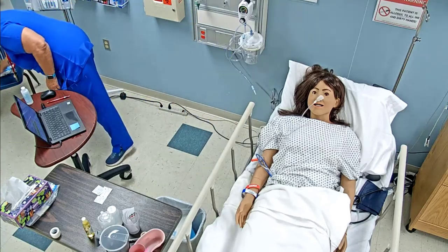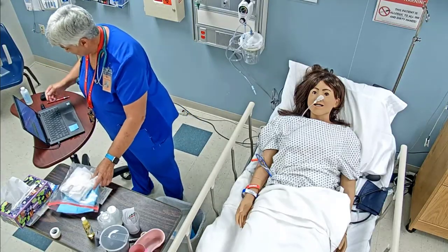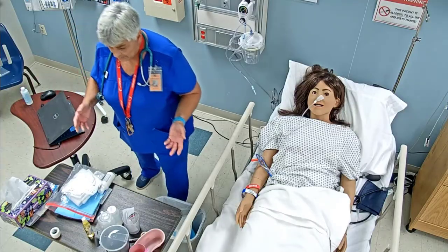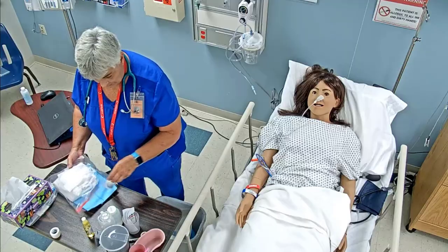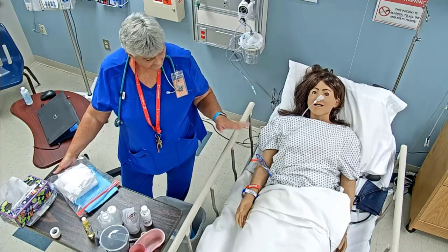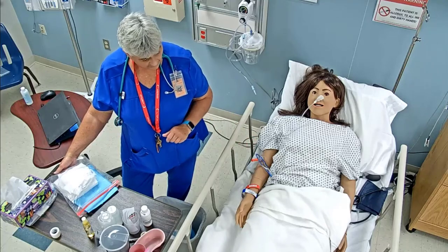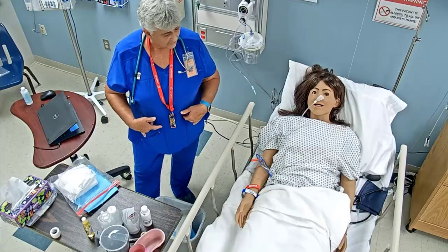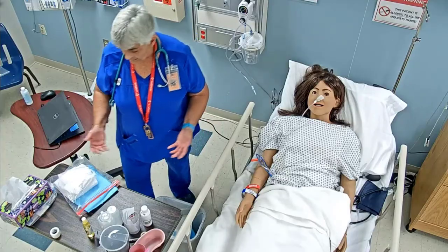I'm going to go ahead and get my supplies. Once I've checked all that, I'm going to shut down my computer and go to the supply list. As I'm just talking about it, for any procedure, we always want to make sure we have good lighting. And again, we're going to be doing an assessment when we get in there, looking at respirations, which they haven't had any problems with, but we're going to look at the abdomen before we actually pull that out. Again, we're going to be looking for distension, any firmness, any tenderness, and we're going to be checking the abdominal girth if we need to.